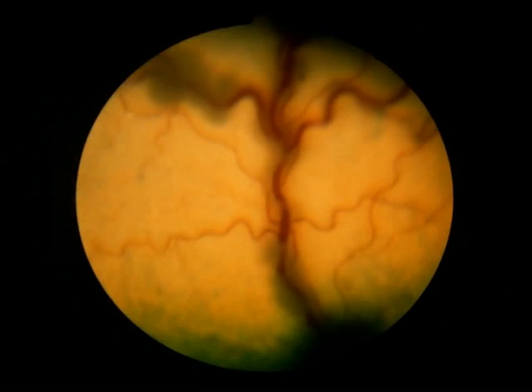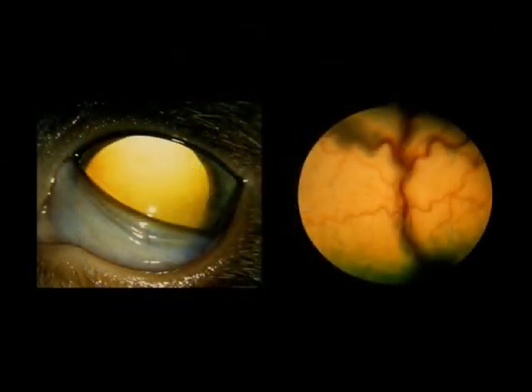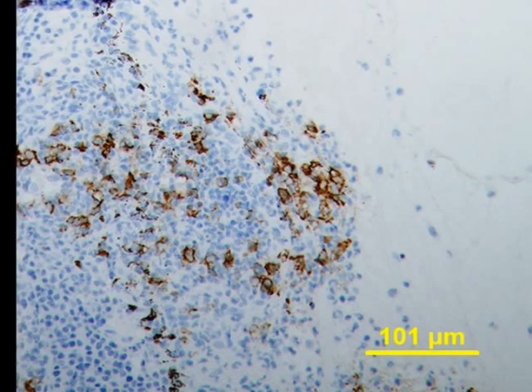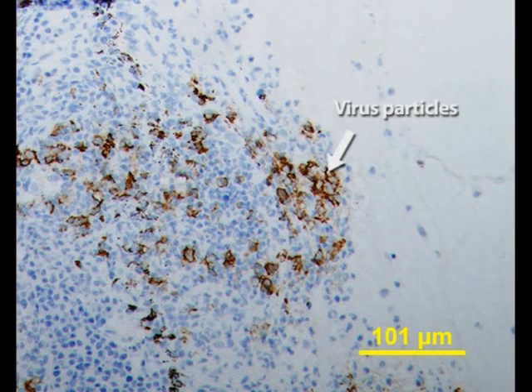Ophthalmoscopy revealed extensive retinal vasculitis. Note the poorly defined edges of the retinal vessels and perivascular discoloration. Compared with the first eye, these changes represent a more typical clinical presentation of FIP with ocular involvement. Usually both eyes are affected on presentation with asymmetrical changes. In this case, FIP was confirmed using immunohistochemistry.